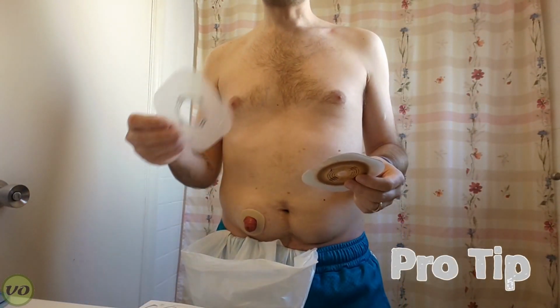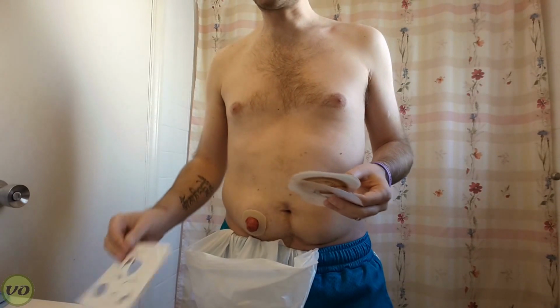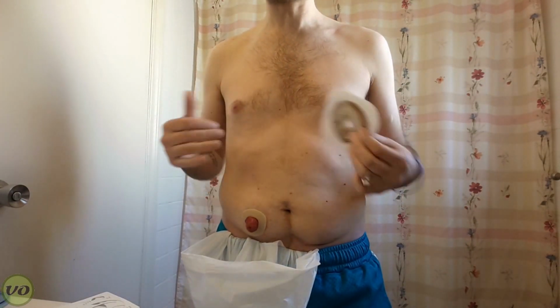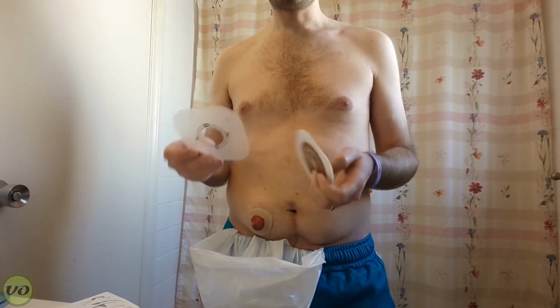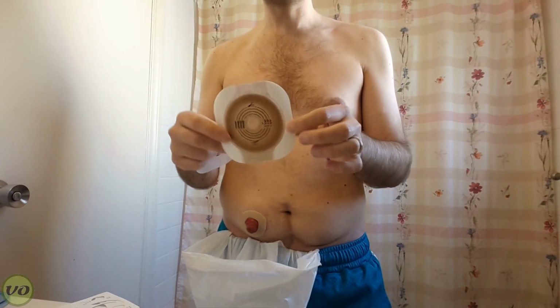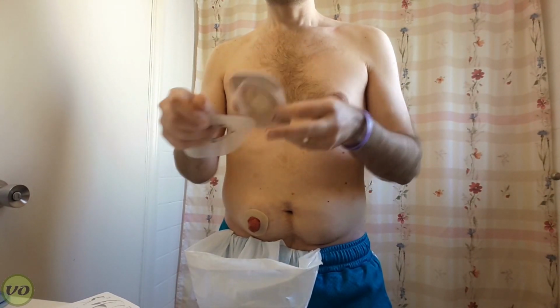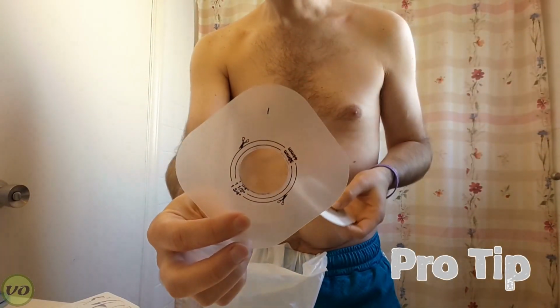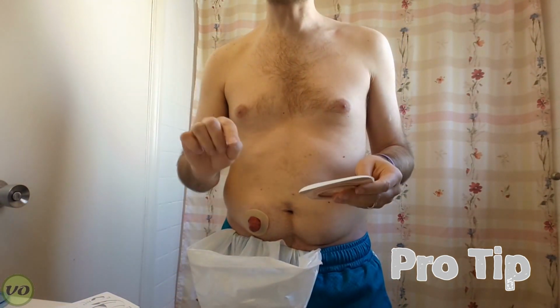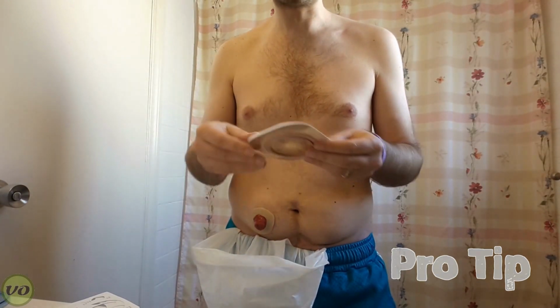What I tend to do is keep my previous template, or you can choose to just use one of the stoma guides, although I find that going with a previous template, especially if you have a stoma that isn't perfectly round, will help you to get a better fit. Now, with the Hollister products, there's no real indication of which side is up or down, and I do try to wear it as a diamond rather than a square. So I tend to mark the top, you can see there, with a little line, just so that I know, because if there's any inconsistency, I want to make sure I'm cutting the right area out to fill that inconsistency.